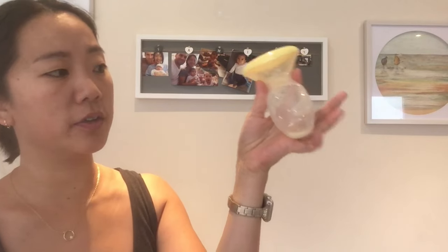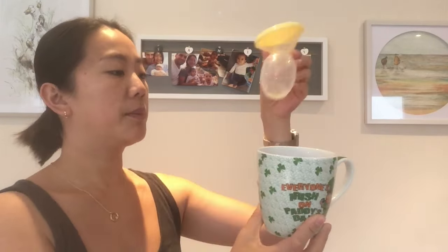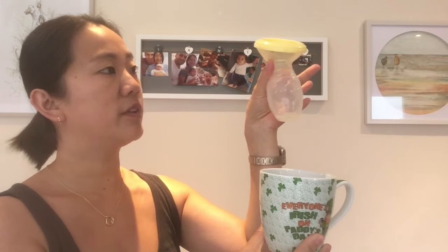A quick tip with the Haakaa pump: these are not very steady at all — the base is very narrow. I usually use these by my bedside, so I keep a cup there on my bedside table. When I'm finished using this, I pop it into the cup so it will not spill over.